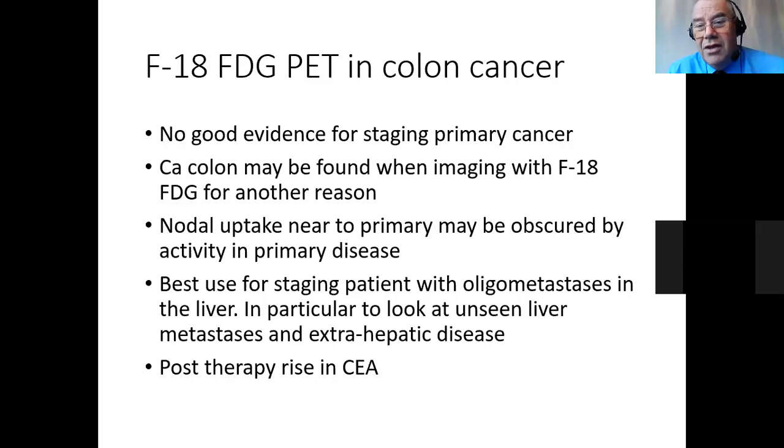However, one of the other issues, as you all know, because you've all done lots and lots of FDG PET scanning, is that we often see focal uptake of FDG in the colon. So is this another cancer? And the problem is that colon cancer is a common cancer, so it may be seen in many patients.